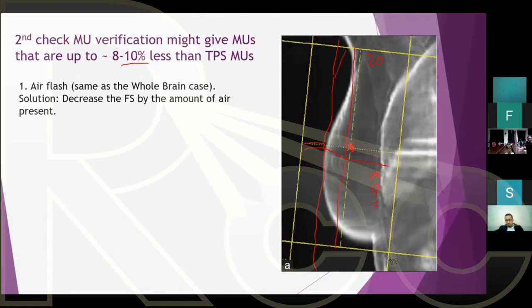And then I estimate how much air is here. Let's say this probably is 15%. Of course, again, this is an estimate. It depends from one person to the other, but it will bring us closer. If you put 15% or 20% or 12% of air, these are small values, don't be hung up on the actual number, as long as you're trying to mimic the actual treatment.